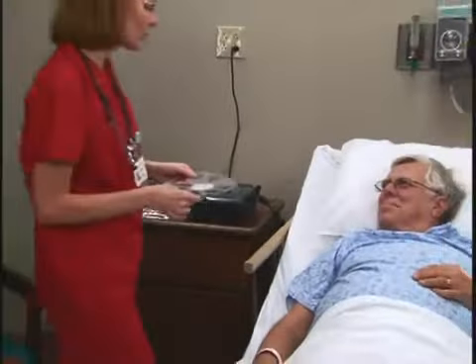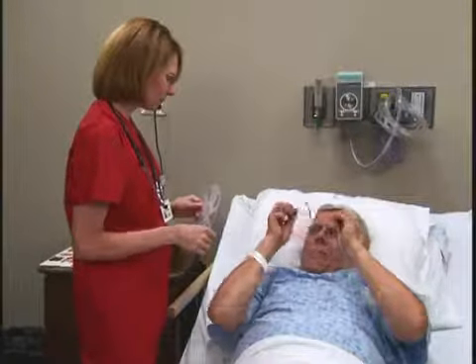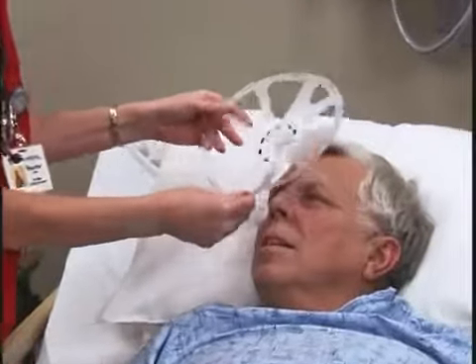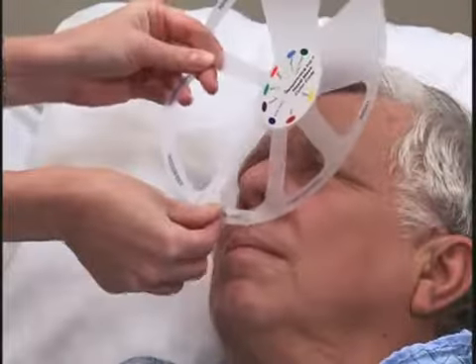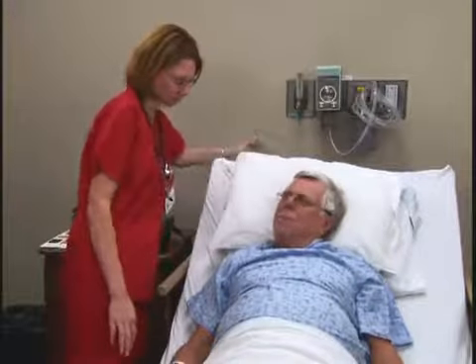Mr. Schroff, I want to measure you for your CPAP. Can you take your glasses off for me? If ordered by the physician, administer continuous positive airway pressure, or CPAP, or bilevel positive airway pressure, or BiPAP. To do this, first determine the correct size mask using a masking chart. How's that? That's better. Good.